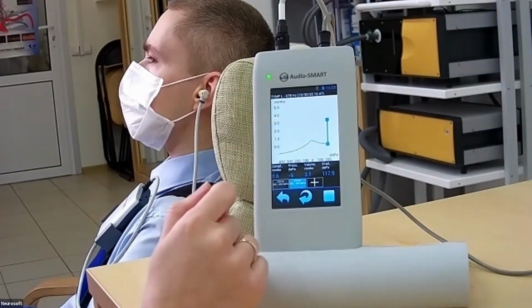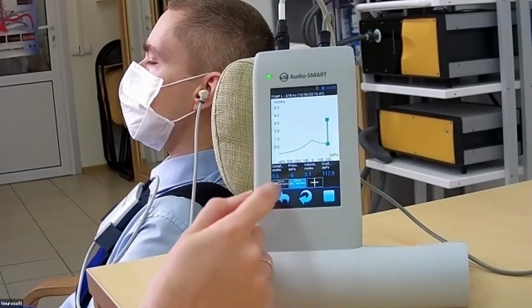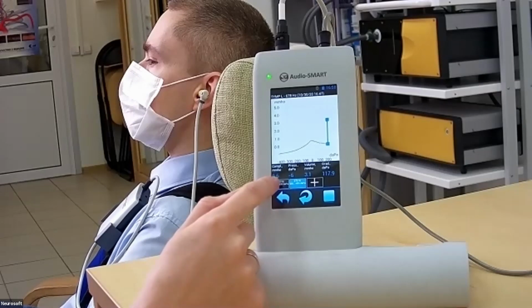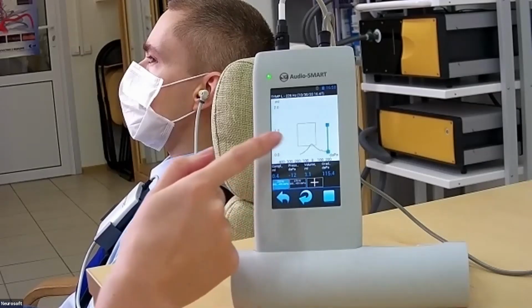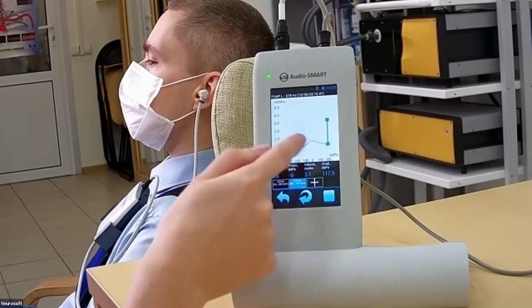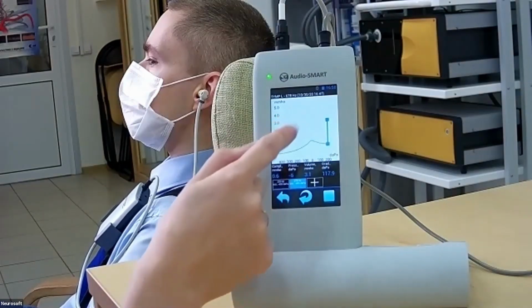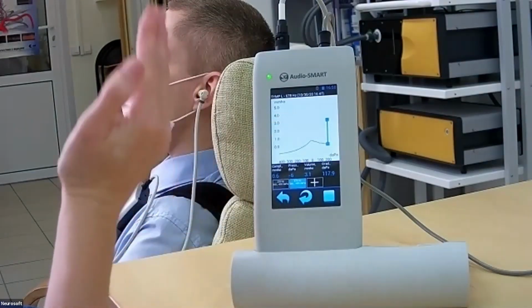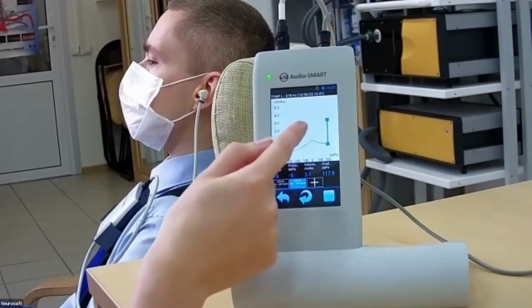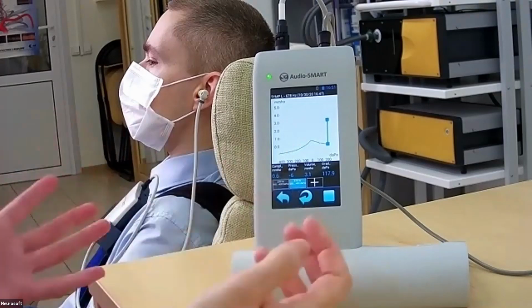It is because in the scientific literature, the main norms are for 226 Hertz only. And here they see only on the orienting of the curve, it must be upward, and they look on the peak. Is it here or no?